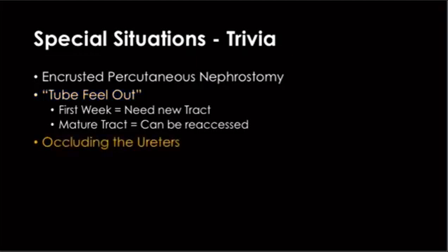Alright, so you may have seen the ureters occluded, like by IR, actual occluder devices stuck down in there, and you may say to yourself, why are they doing that? So urinary occlusion may be necessary in addition to urinary diversion in patients who have urinary leaks or fistulas or urinary incontinence or intractable hemorrhagic cystitis.